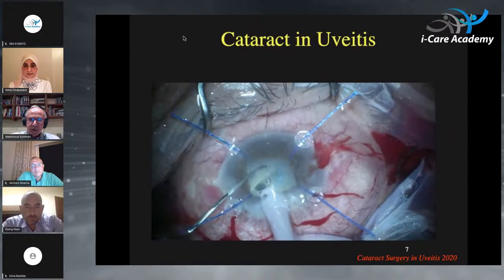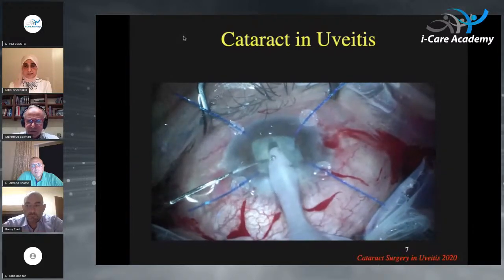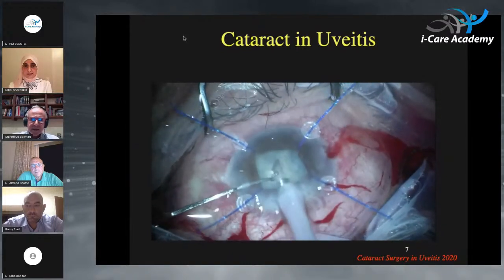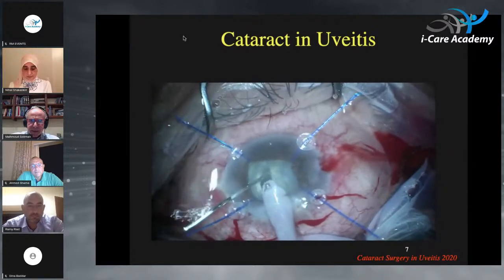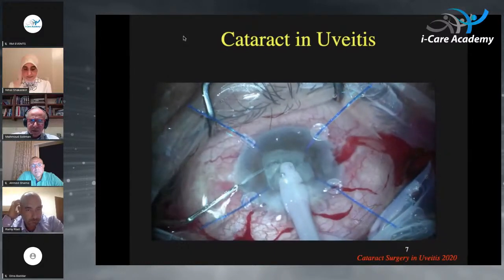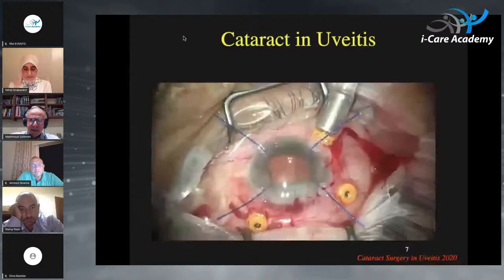This is again one of those patients with a hard cataract because of long-standing chronic uveitis, as you can see from the anterior segment. Usually the phaco is straightforward. You really need to do a proper capsular rhexis. This is important. And the phaco is no problem. Okay, this is the end of the surgery. The lens is in place in the bag.